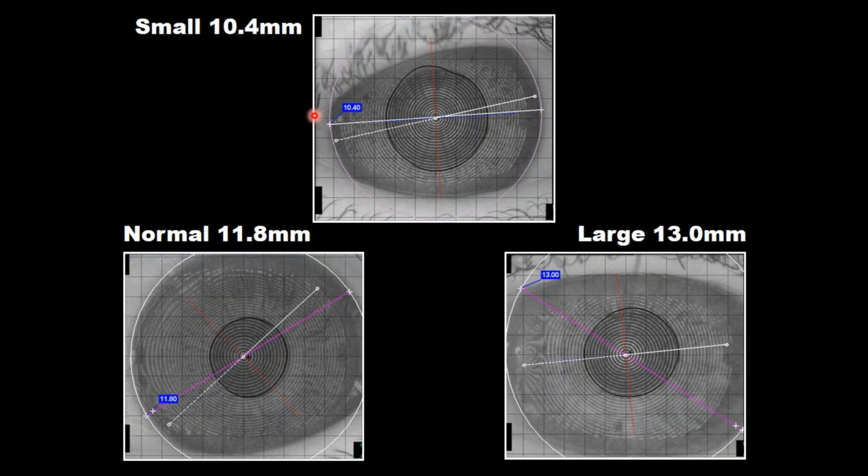As an example, if the patient was struggling with comfort, we would have noticed that we were putting a 10.6 on a cornea that's much smaller and possibly the edge would be impinging. So that would have told us, if we would have checked for VID beforehand, maybe we should be custom ordering the right diameter of lens before we send the patient home with it.